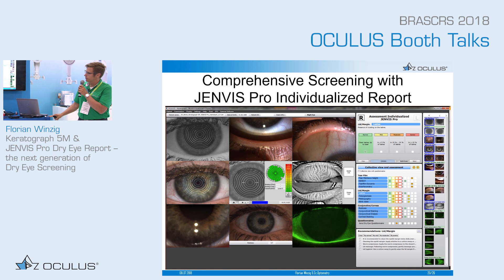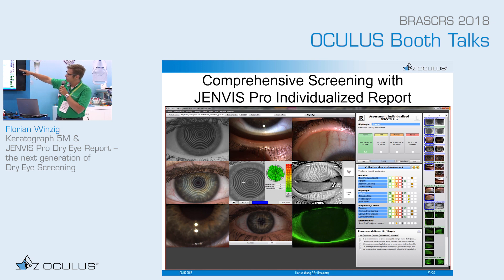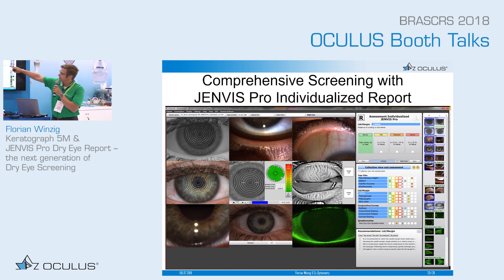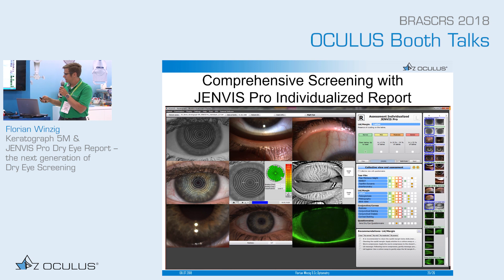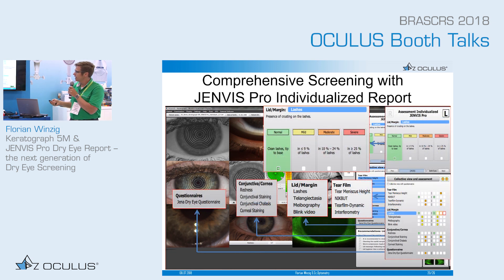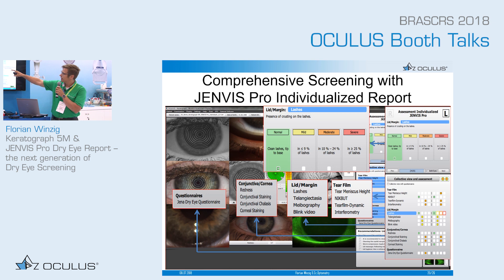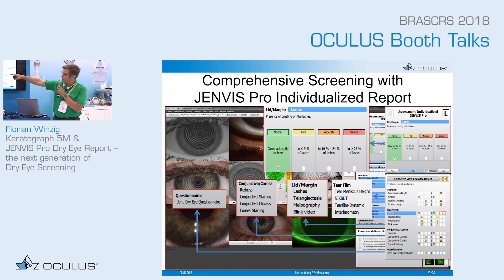Once all capturing sessions are finished, you move to the assessment step. Here you have all captured images and videos. By clicking the 'collective view and assessment' button, all useful images and videos appear on one screen for a quick assessment. To support a thorough diagnosis, findings are separated into four subcategories: tear film (tear meniscus height, NIBUT, tear film dynamic, and interferometry); lid and lid margin and lashes.